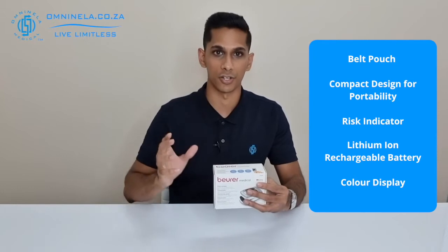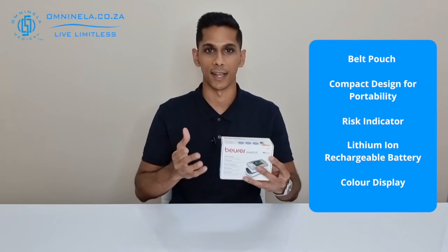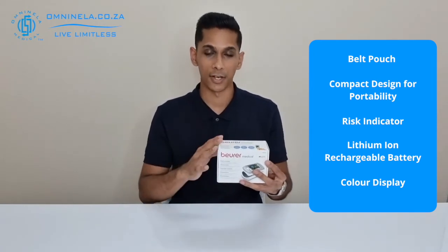Straight off the bat, the PO80 instead of coming with replaceable AAA batteries, they've gone with a lithium-ion rechargeable battery that will be built into the device itself, and this goes hand-in-hand with a few things regarding this device.